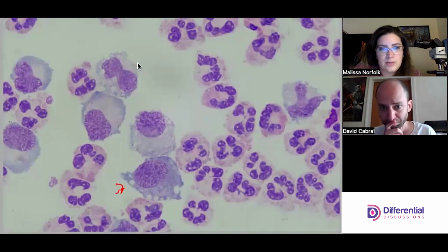I'm comparing them to the things that I know are monos. So I know this is a mono. Then I'm looking at the chromatin patterns. This chromatin pattern doesn't really match this chromatin pattern. I think it matches more closely this one, although this one doesn't match that one either. I think these are more of our monos.